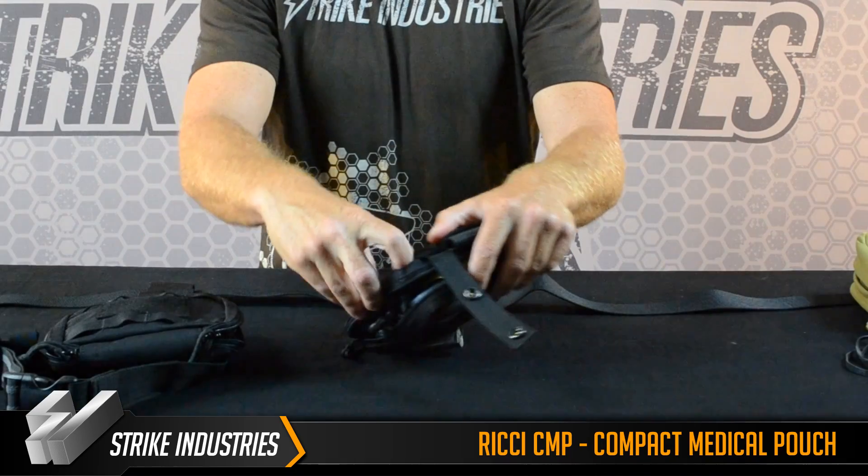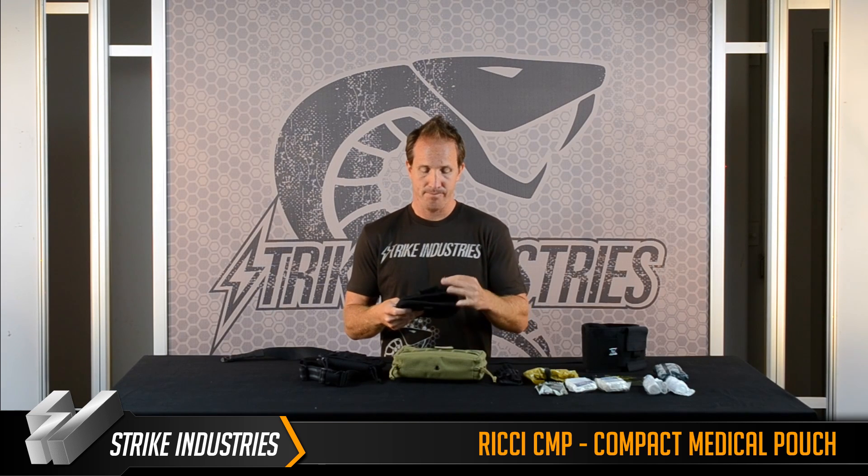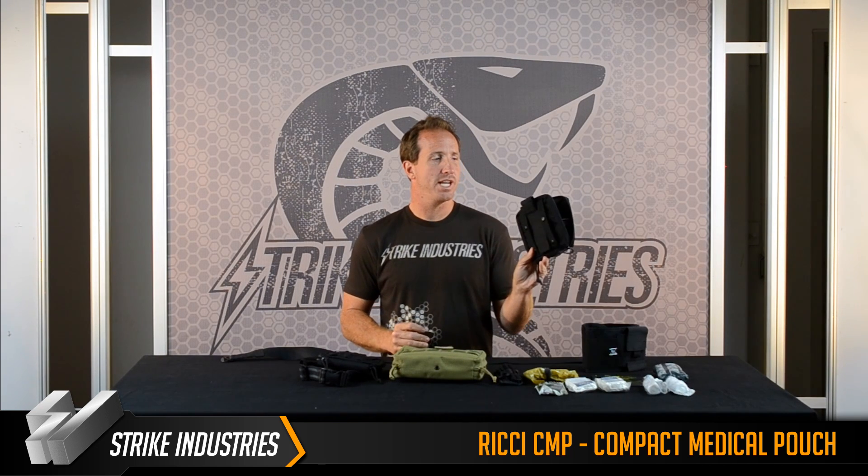On the back of it, if you notice, it does have two little openings, and that's where you can put either a rescue hook or scissors into it. If you really didn't want to use the leg drop, you could also attach this standard to a belt.